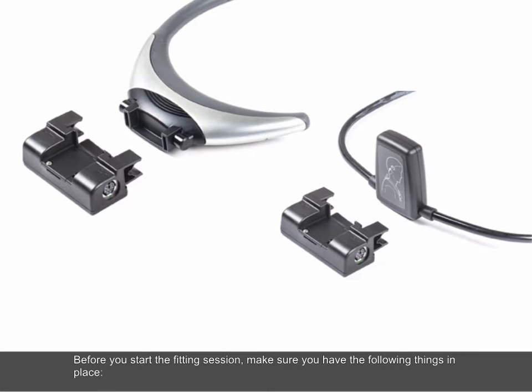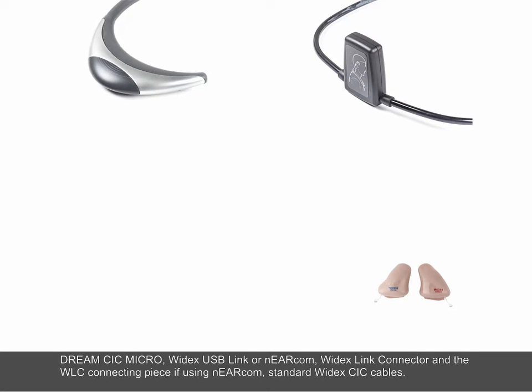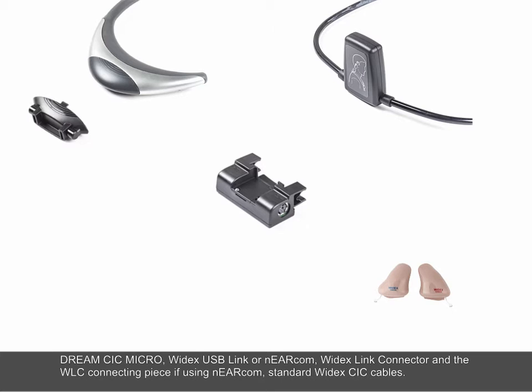Before you start the fitting session, make sure you have the following things in place: Dream CIC Micro, Widex USB Link or Nearcom, Widex Link Connector and the WLC connecting piece if using Nearcom, and standard Widex CIC Cables.